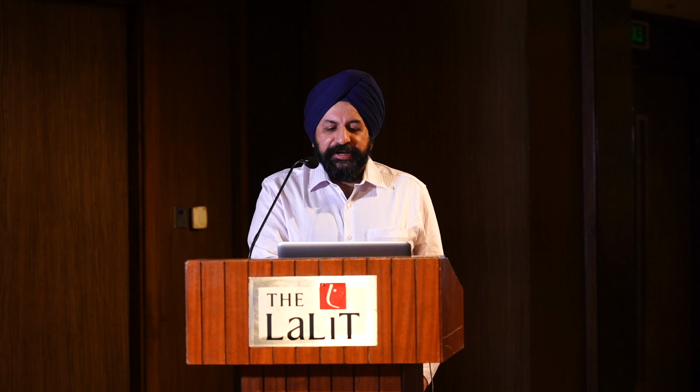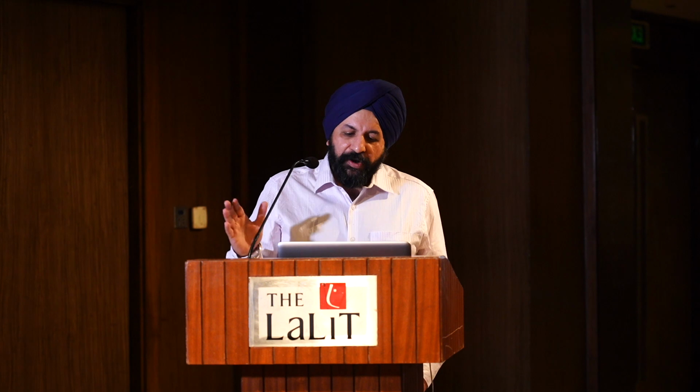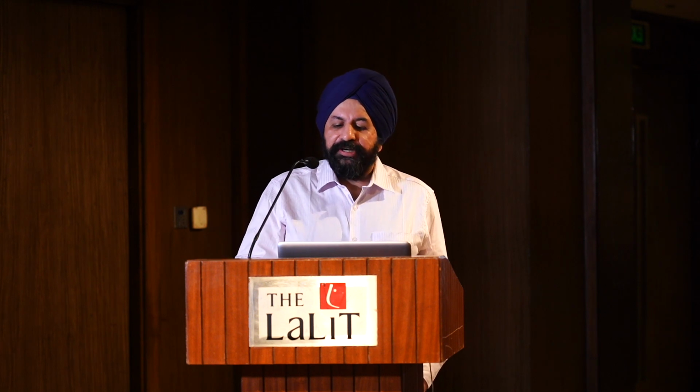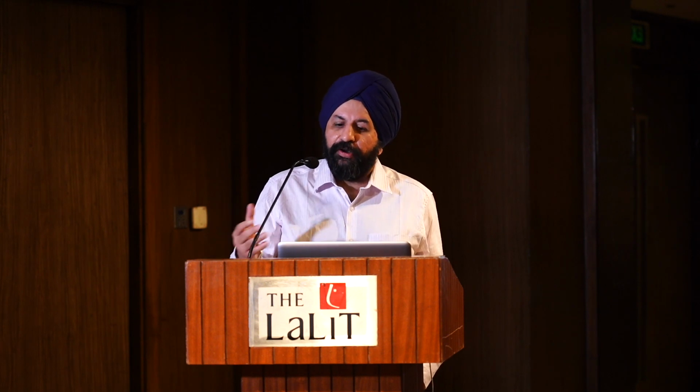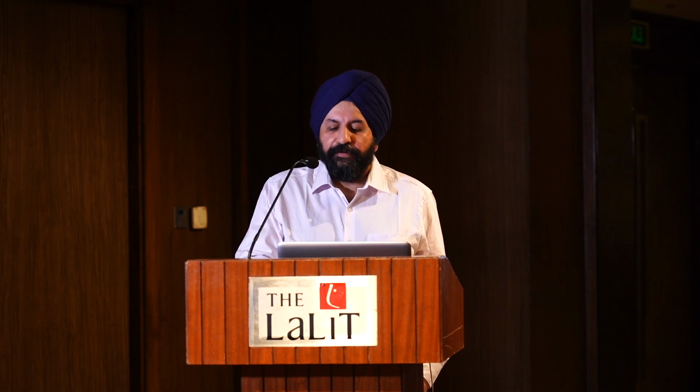So first, coming to nucleated RBC, we all know that when there is severe demand for RBCs or when there is stressed erythropoiesis, there is increased nucleated RBCs into the bloodstream. Now most modern analyzers can do these automated nucleated RBC counts along with your normal differentials, and can also auto correct the TLC which is falsely elevated in the presence of the nucleated RBCs.